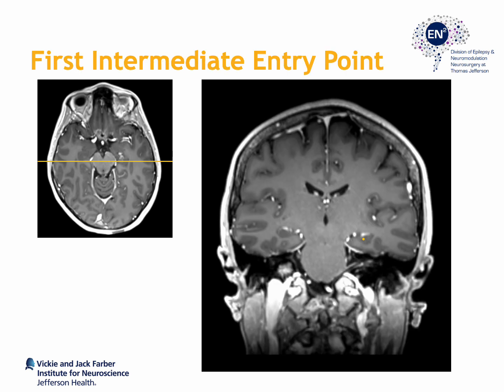Next, I move back to the level of the hippocampal body where the hippocampus is most concave relative to the brainstem and ambient cistern. I define an intermediate entry point located within the hippocampal body itself, positioned relatively medial within the hippocampus in order to ensure that the most medial portions will be covered within the ablation. This point is typically one quarter or one third of the way from the medial border of the hippocampus.